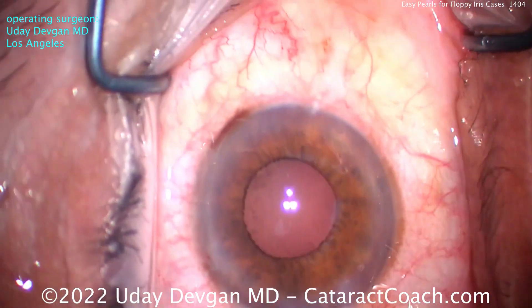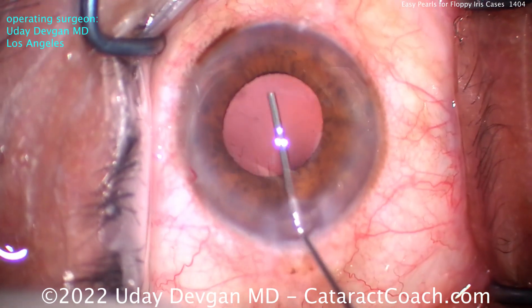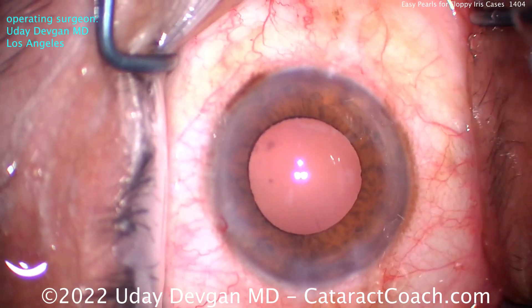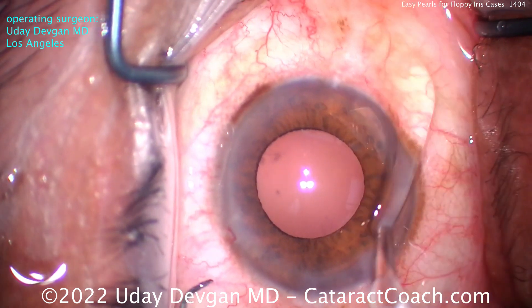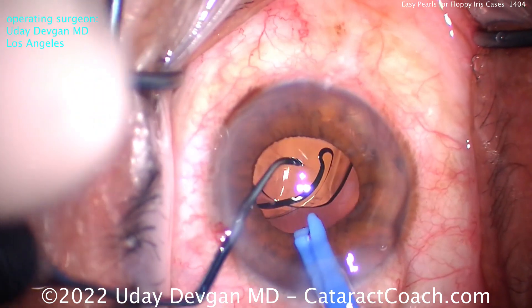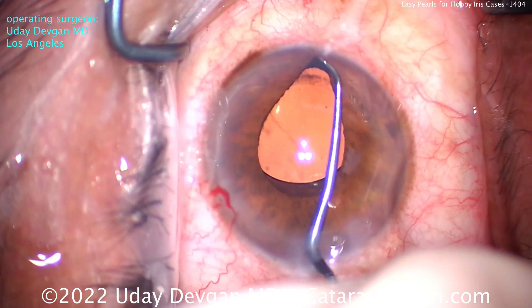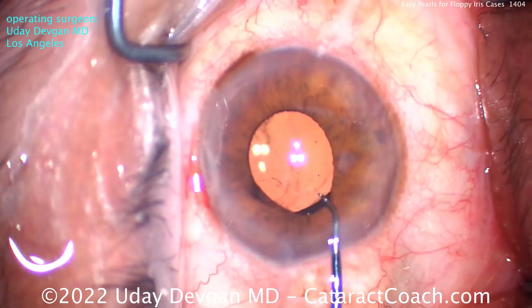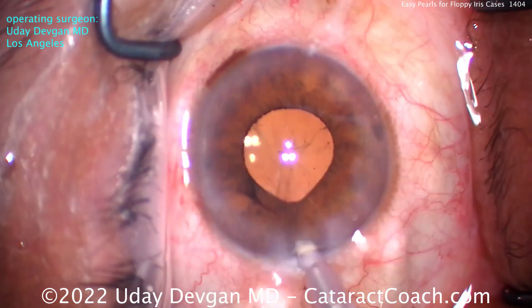At the end we can check again — look at the pupil coming down again. Our cohesive viscoelastic is going to help expand the capsular bag and expand the pupil, giving us a good view. You should be able to barely see the rhexis. Here comes the lens — a single-piece acrylic lens placed right in the capsular bag. This is a preloaded lens coming down the injector with a CO2 cartridge. We use the second instrument to make sure the lens goes in the bag. Then use the chopper to lift the iris and check under the rhexis for 360 degrees — make sure the entire lens is underneath the capsulorhexis edge and there is no retained cortex in the eye.